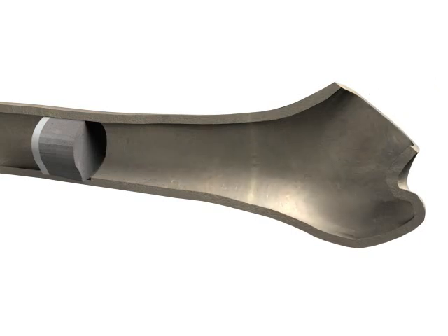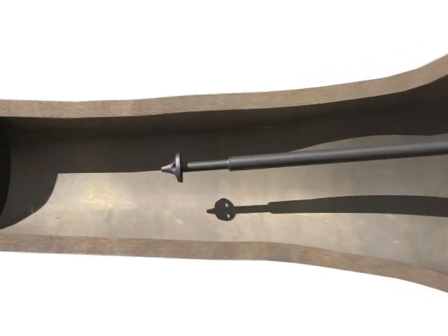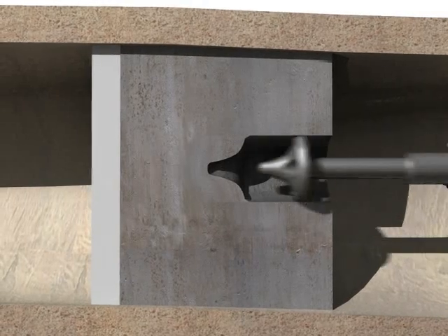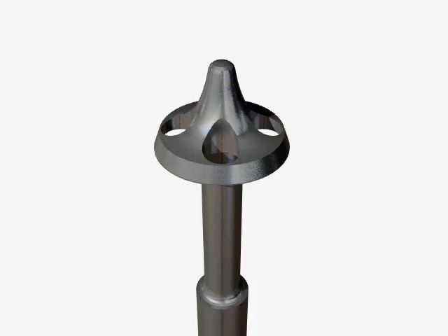For removal of the cement plug, Oscar utilizes specialist piercer probes. These work in a forward motion, with the liquified cement flowing backwards through the holes and collecting behind the head. After each pass of the probe, the hardened cement should be removed from the tip.